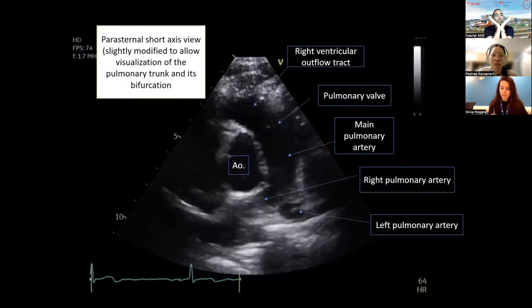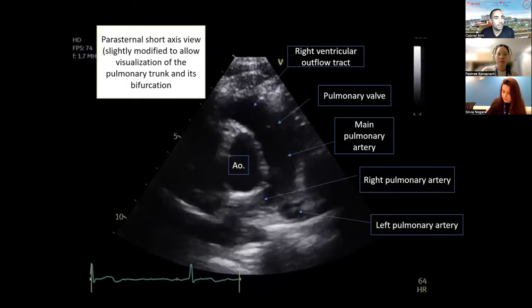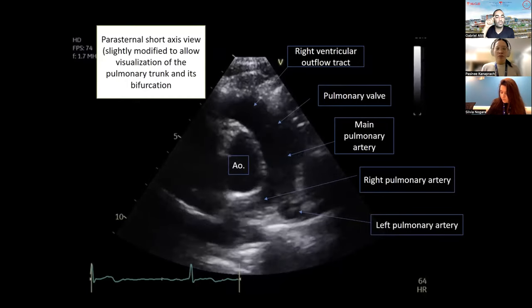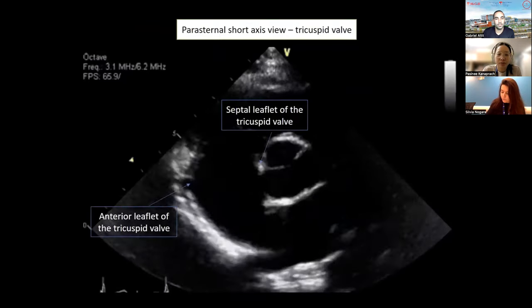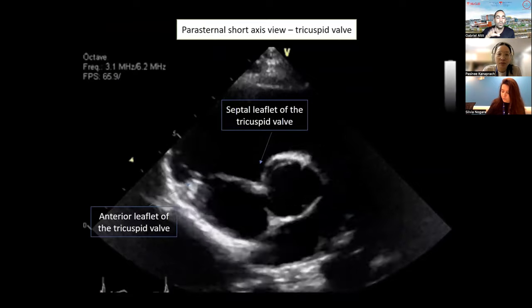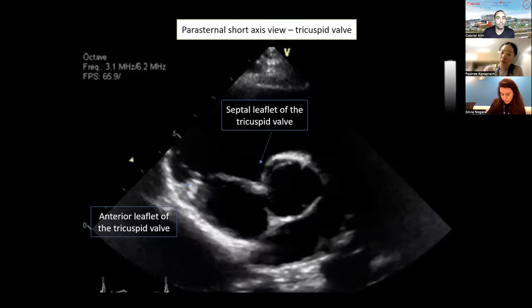And as they grow, these pulmonary arteries are going to become more aligned. And that's why often they get a bit of a murmur of flow acceleration in the pulmonary artery. And we call this a benign murmur of peripheral pulmonary artery stenosis. So sometimes we do just Doppler these to make sure that there's no signs of functional pulmonary artery stenosis. We'll put the color to make sure there's blood flow. If you do just a pulsed wave Doppler, you're going to see that there's acceleration because there's a bit of turbulence.